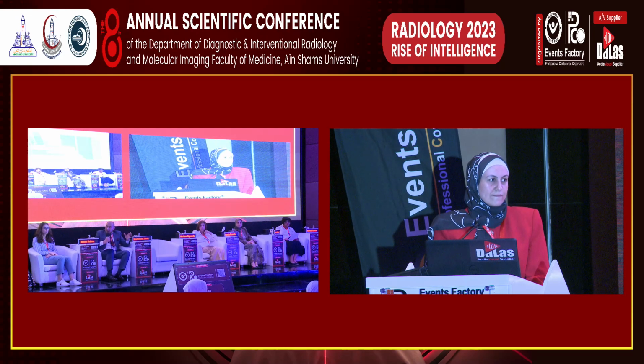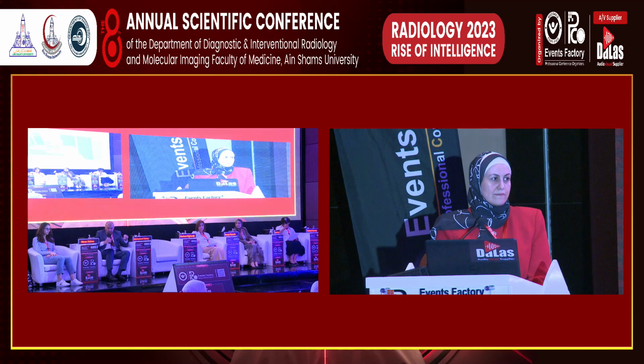It's a large trial in the oncology field. They enrolled more than 9,000 patients to receive chemotherapy and hormonal treatment for patients with advanced prostate cancer. And they advise that oligometastatic patients should receive SBRT, stereotactic body radiotherapy, or local treatment for their bone mets. And PSMA PET added value for those patients because it tailors the nodal selection for radiotherapy or for local treatment by surgery, even for the patient in a metastatic setting with fewer than three lymph nodes. That's why PSMA PET is fine-tuning our practice in prostate cancer, and also selecting our radiotherapy to the hidden sites, maybe the cause of PSA failure.